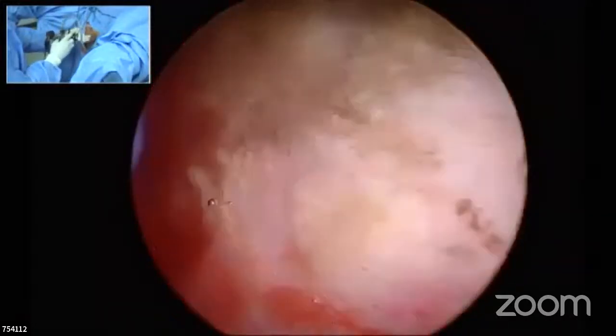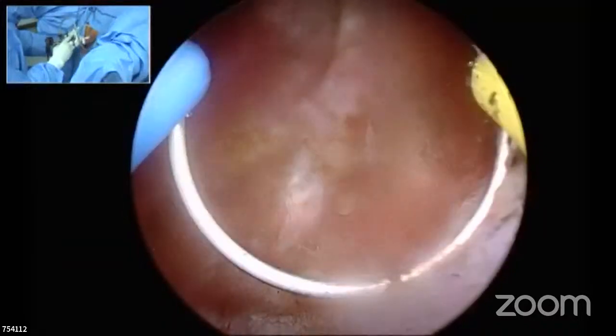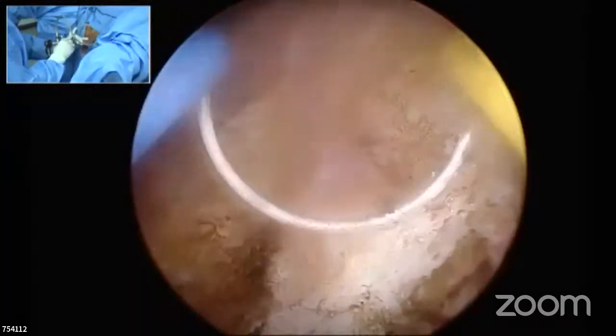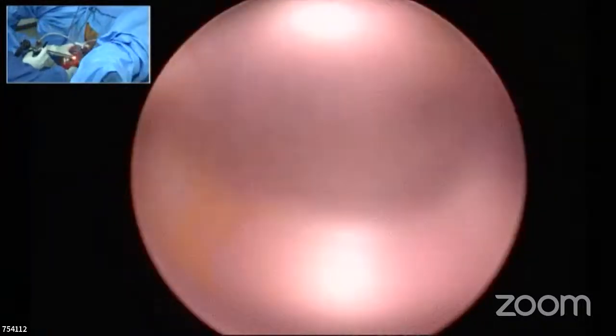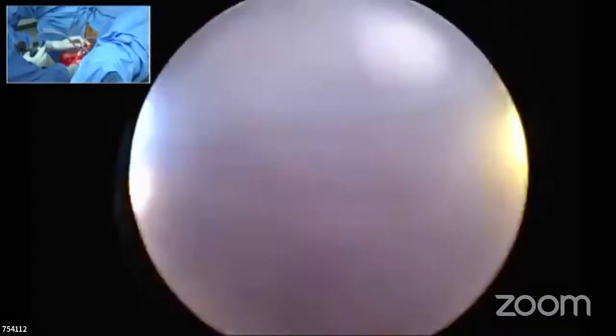I think possibly somebody can comment on that. Yeah. See, Malli, show them how you do this extended cut. That means you take the cut, you pull the resectoscope and it becomes an extended cut so that you can resect. And is there a difference between resection in the monopolar and bipolar? I mean, the speed of resection.